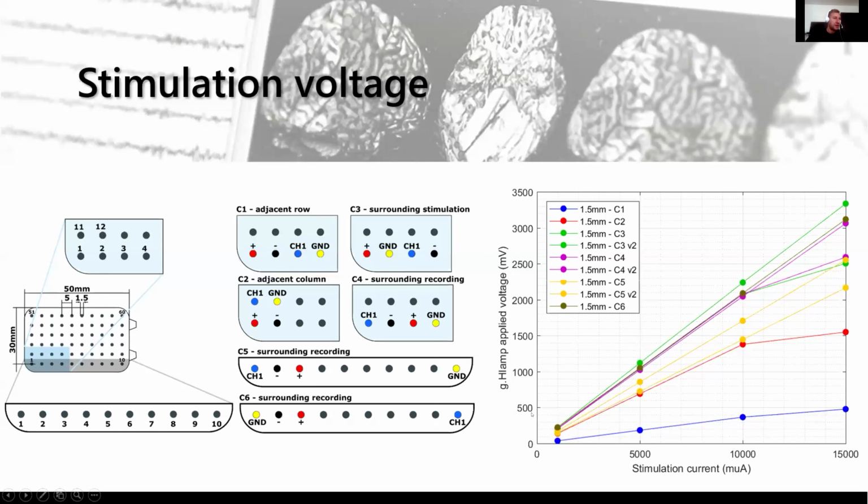If you get to very high stimulation voltages and tiny electrodes, you have to be careful so that the stimulation voltage is not exceeding the supply voltage, of course, of the input stage of the amplifier, because with that you can then bypass the current out of the brain into the device. So this is very important to understand, and we can control that here, of course, with the standard electrodes. If you have a custom electrode that might require higher voltages or higher impedances, then of course we have to be careful and measure that beforehand.